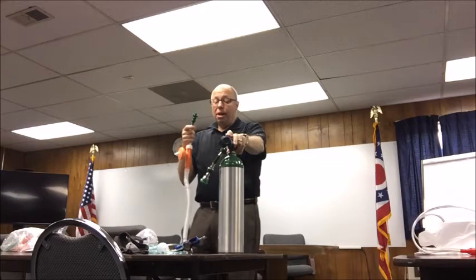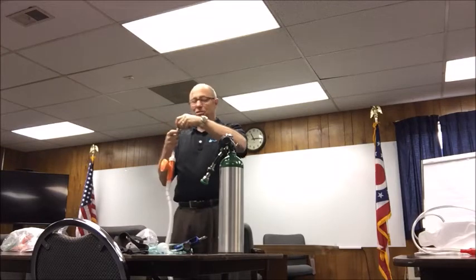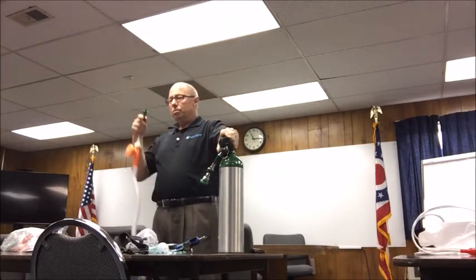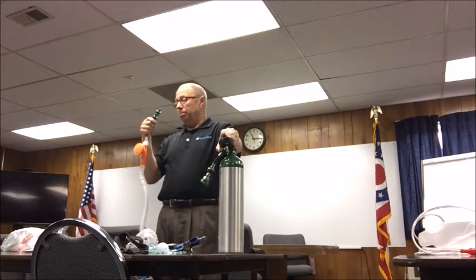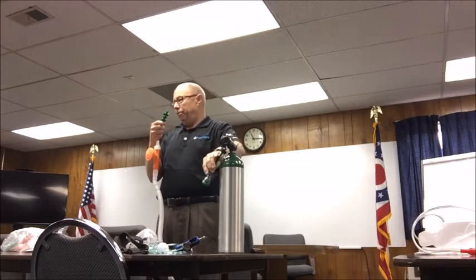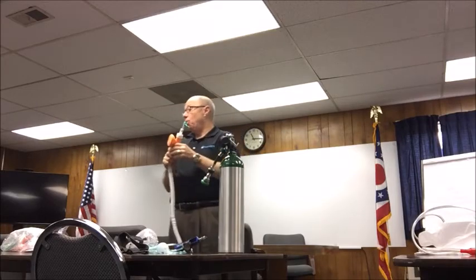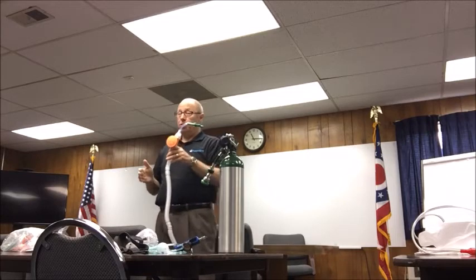So, if you don't have a pigtail on the tank, the redundant system is to take this off and screw it into the high pressure port. But we do. So, what I said earlier about that being a direct source to the oxygen. Everybody says we're going to run through oxygen very, very quickly. Well, what happens when I plug that into the high pressure port? We gate that down, and we only pull 15 liters a minute from the tank. Okay? And we pull 125 liters from the ambient air, which gives us our flow of 140 liters at a fixed FiO2 of 30%. I cannot change that in this configuration.